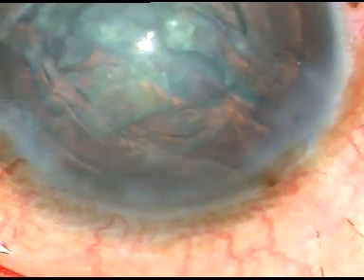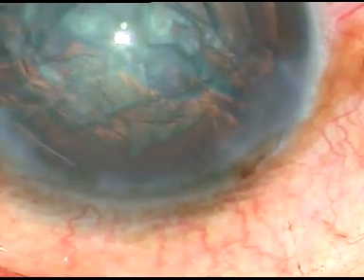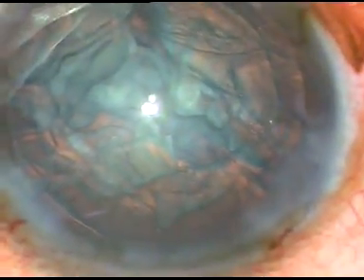Now viscoelastic substance is injected again, and now again I go into the eye with the phaco handpiece.